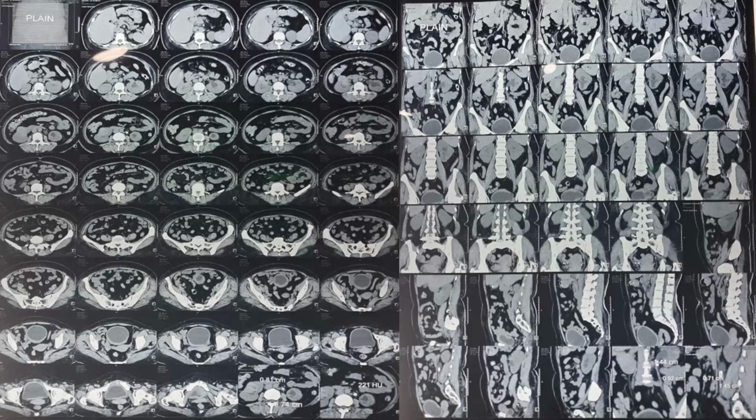Dr. Sir has said that contrast CT can very well be a CT urogram. He said that you please mention that you are asking for renal cell carcinoma or malignancy, so they will do accordingly. And he has told you how they are going to do the CT scan.